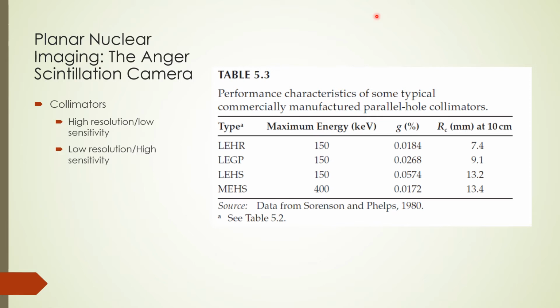This type of collimator blocks photons from reaching the detector because of having numerous cylinders and septa, and is therefore also low sensitivity. The opposite of that is a collimator having fewer short cylinders of wider diameter and thinner septa. This type of collimator is low resolution but also higher sensitivity because it blocks fewer gamma rays from reaching the crystal detector.